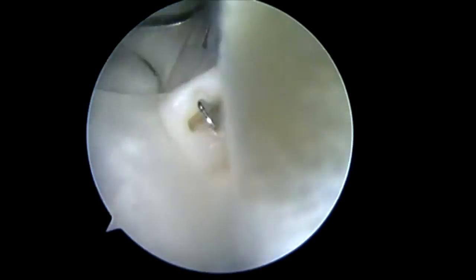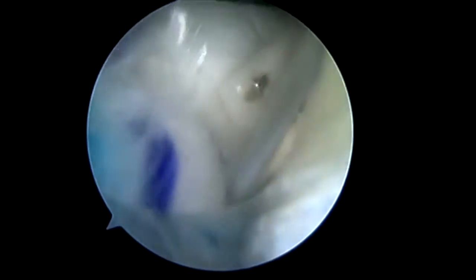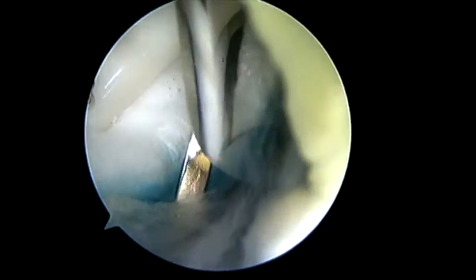We want to fixate this medially, anteriorly, and posteriorly with these blue absorbable staples that come with the kit. And once we've got adequate and secure fixation, then we'll move laterally.